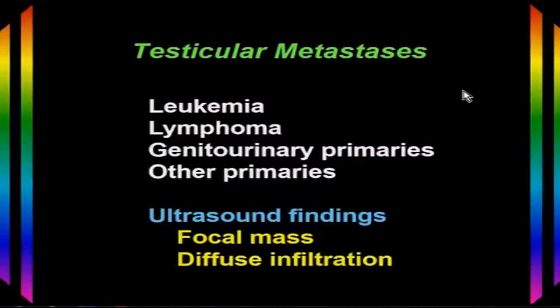We occasionally encounter metastases inside the testicle. These look like tumors because they're focal lesions. We may see leukemia or lymphoma. Sometimes genitourinary primaries will metastasize to the testicle, and rarely other primaries may be seen there as well. On ultrasound we'll see a focal mass in most cases, but occasionally metastatic lesions will show diffuse infiltration, particularly lymphoma or leukemia.